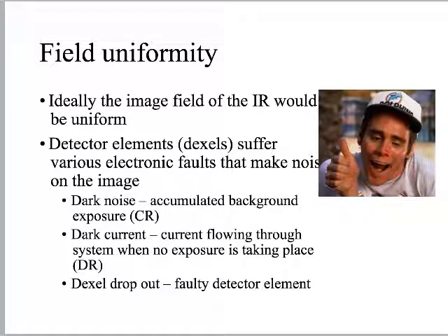But it has these 5 quadrants that it's going to test. It's very interested in these 5 quadrants. They will always be the same. It'll always look like a 5 on the dice, right? Because it's looking at the upper corner, both upper corners, both lower corners, and the middle, right? And it's averaging between those. You can see there's different numbers given for the darkness in these different corners, right? And it's saying between these different areas, kind of distributed across the image receptor, there's this amount of variance. So let's just average it all together, right? Now we have something that's fairly uniform.